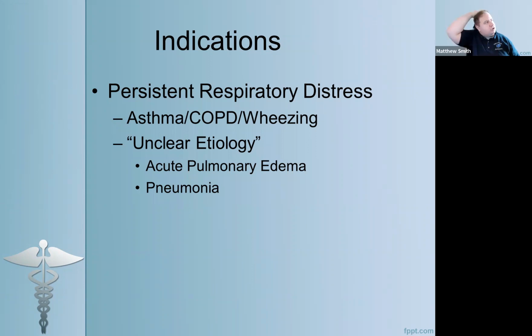If you have a patient who no longer has respiratory distress, but instead has progressed to the point of respiratory failure, you're also not using this, right? So the patients we're talking about are patients that are remaining in this state of respiratory distress, where they're struggling to breathe, but they're still able to do it.